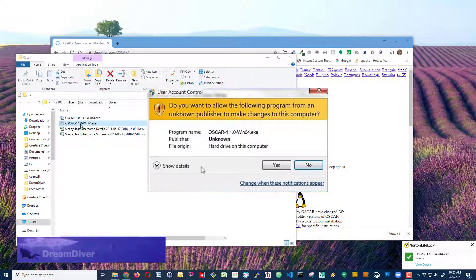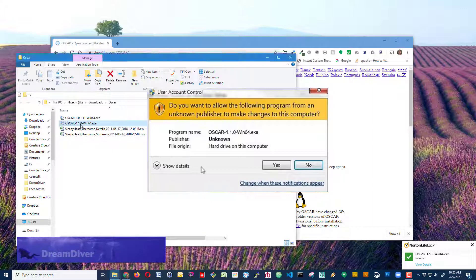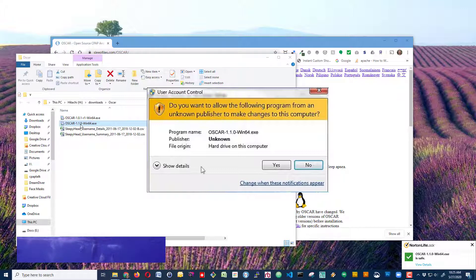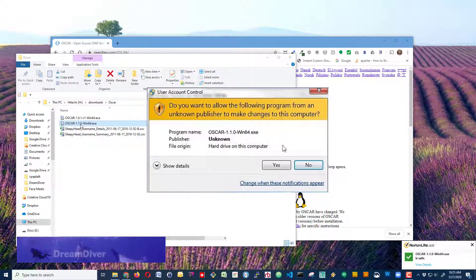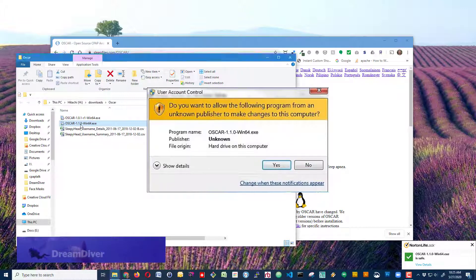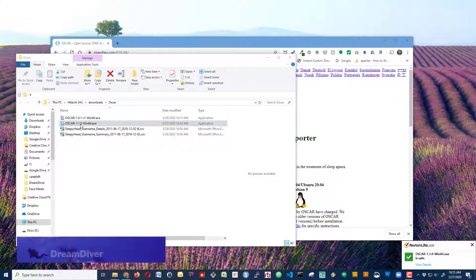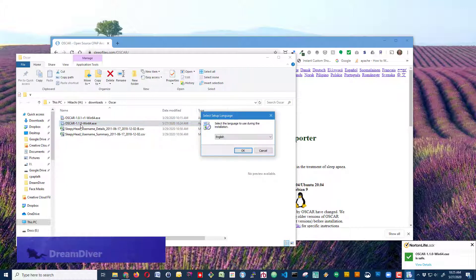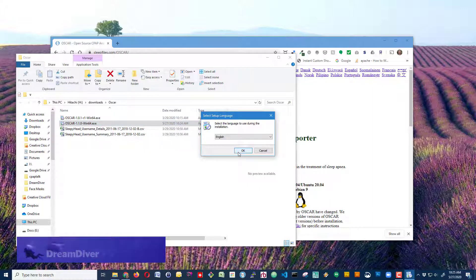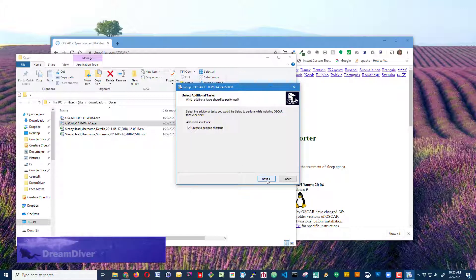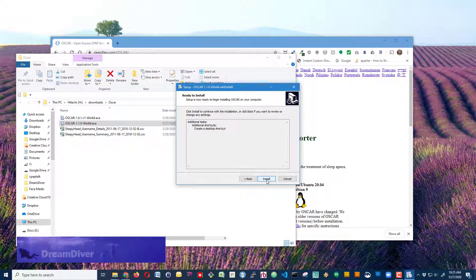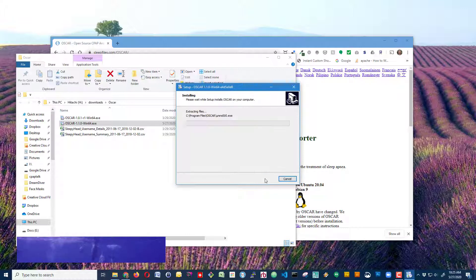I'll get this prompt asking me whether I want to install it. All I have to do is click yes, because we do know that this unknown publisher is verified and trustworthy. I'm going to click English and create a desktop shortcut, and then I'm going to install.